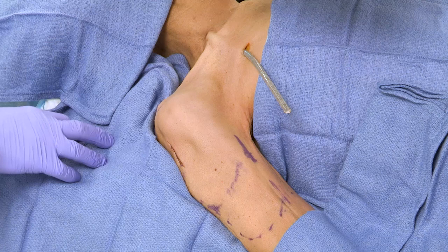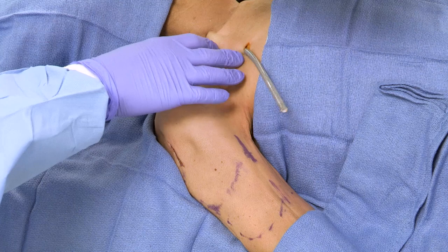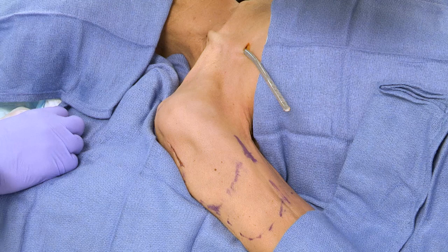Today we're going to demonstrate this in a cadaver lab. We have a separate outflow component and sort of a placeholder as what would usually be the tunnel dialysis catheter. As you can see, that's tunneled across the chest and exits in the infraclavicular area, which is sort of the common spot. We've already made an incision over the neck where the catheter inserts into the jugular vein.